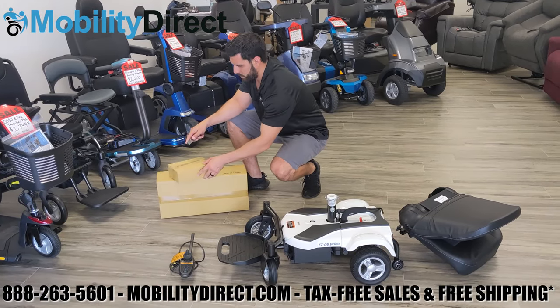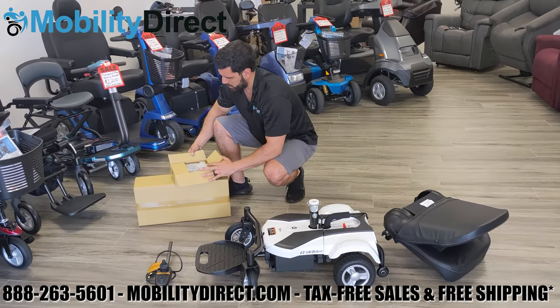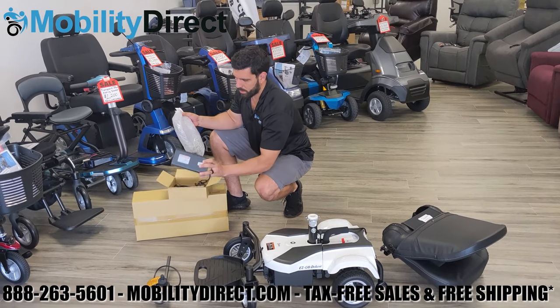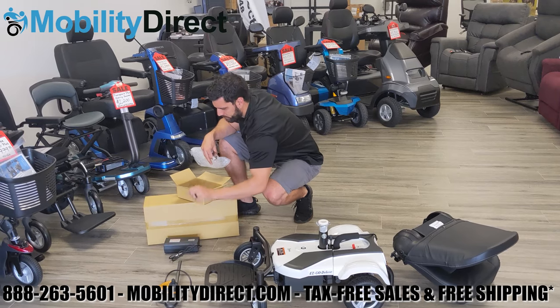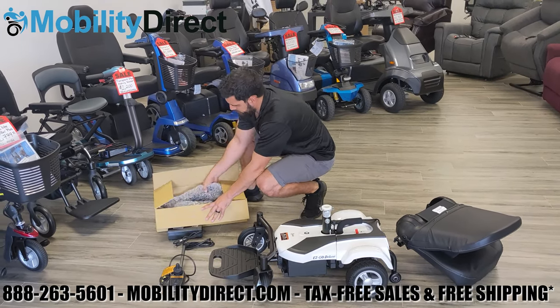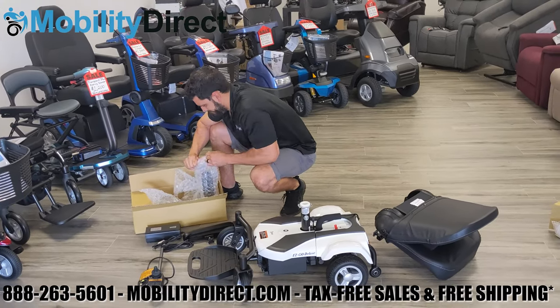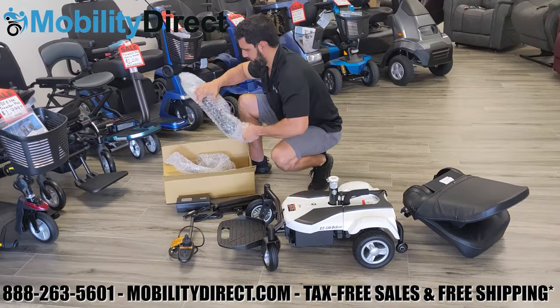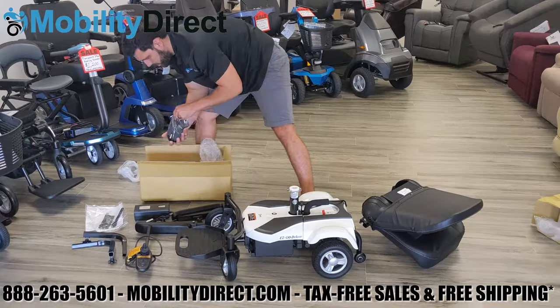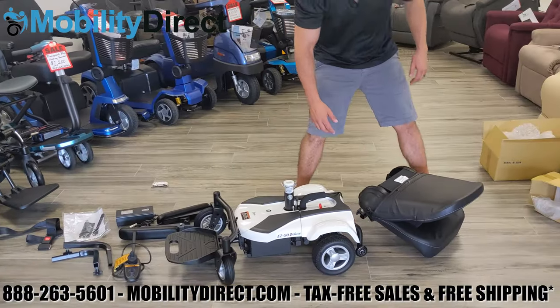We're going to continue to unbox the rest of the components, such as the charger. Remove the charger from the bubble wrap bag it's located in and put it to the side. Continue to unpackage the remaining components like the armrests and the armrest 90-degree brackets, which you'll need to attach the actual armrest pads to. It also comes with a seat belt — put all that to the side and then we'll get started with the seat.